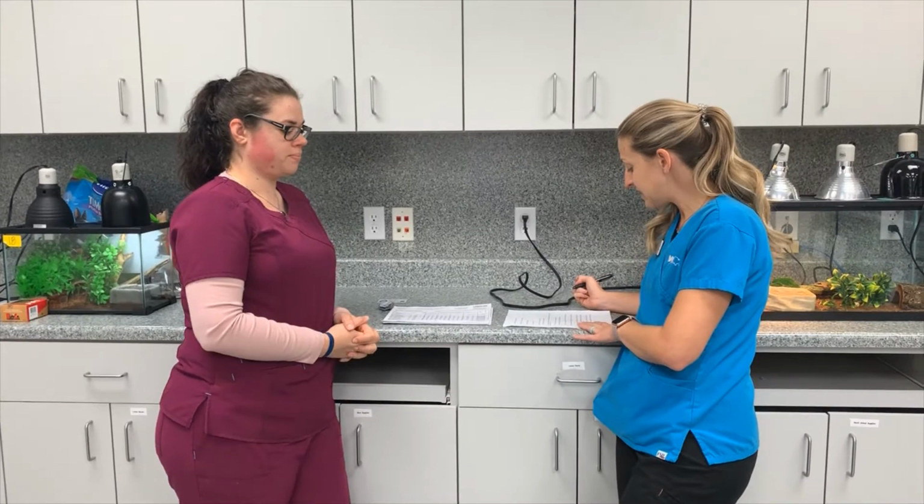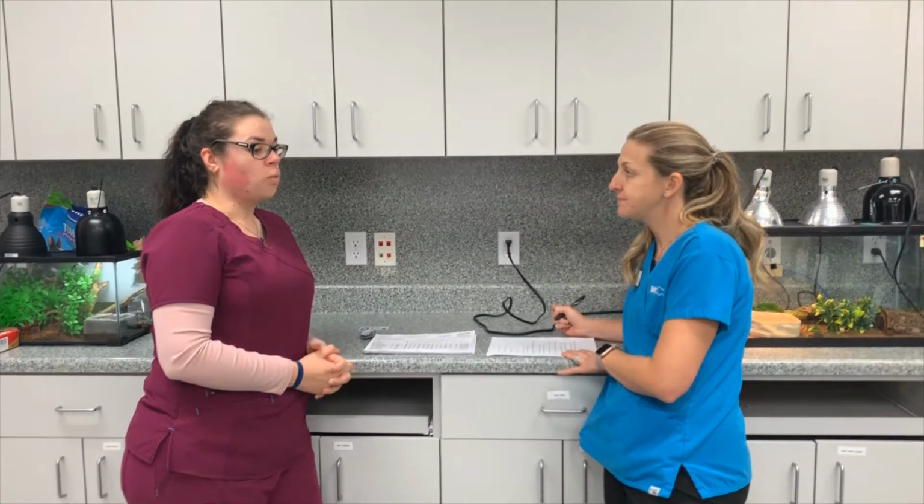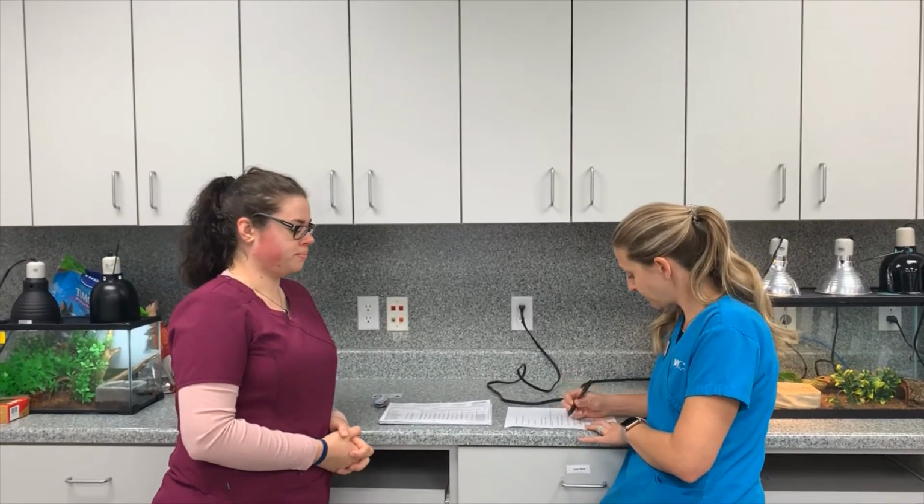How are distance and the exposure setting on the machine utilized as a safety precaution? For exposure, we want to get the fastest exposure time with the lowest MAS. And then for distance, we want to put as much distance between ourselves and the beams as possible.